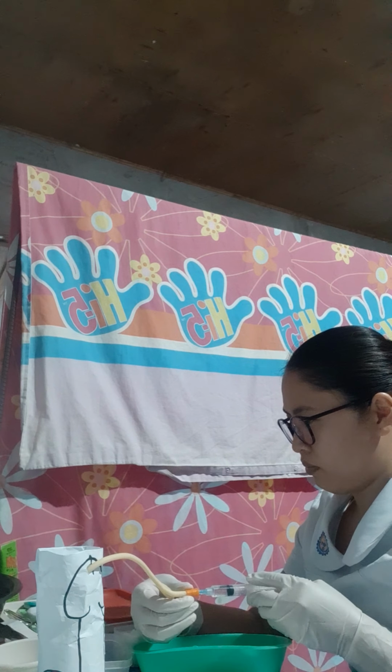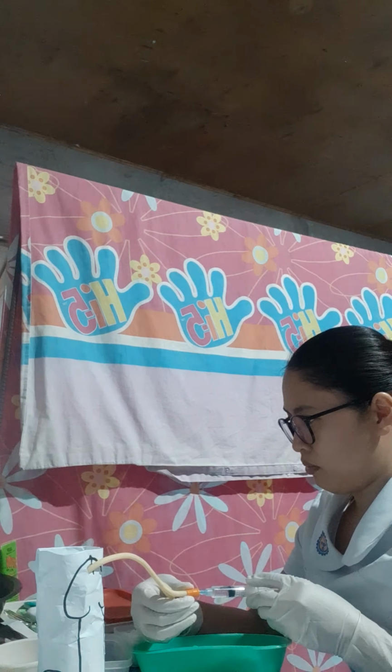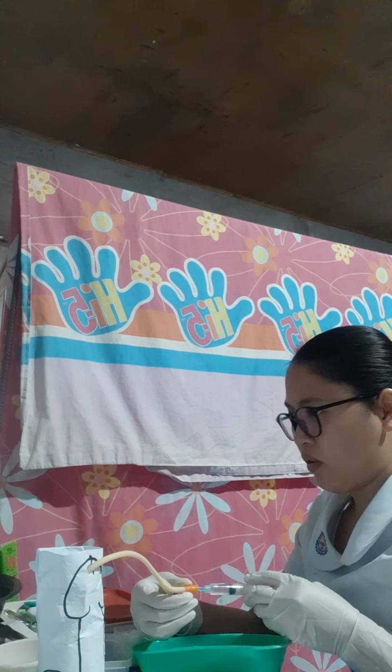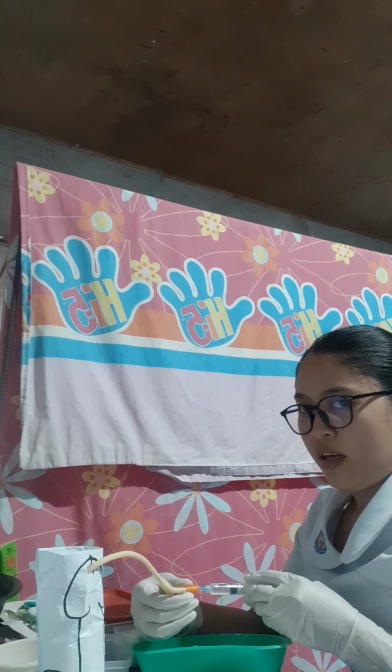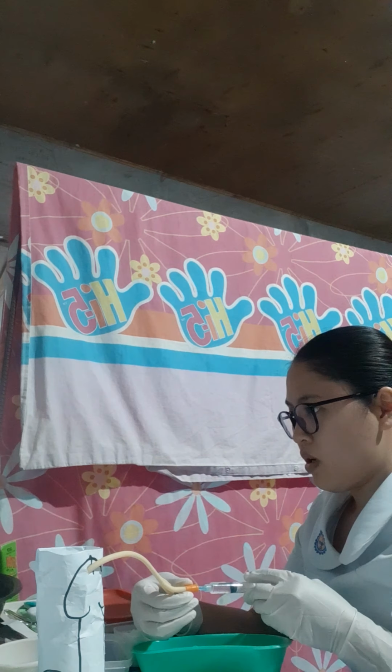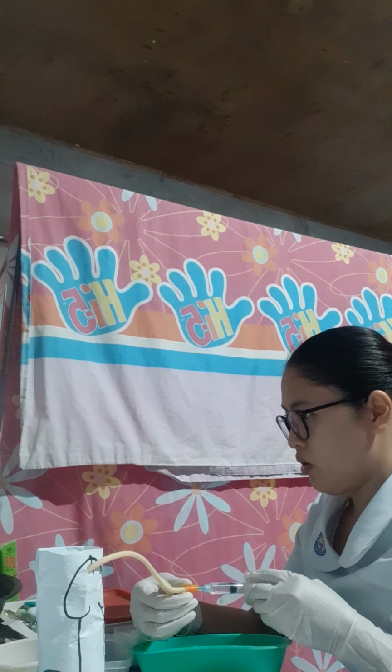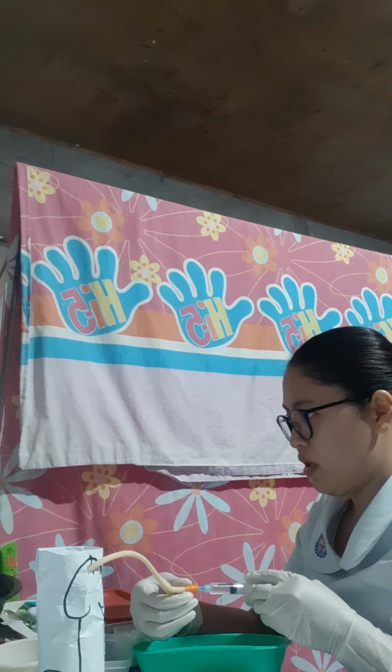Then if the patient complains of sudden pain while injecting it, we are going to aspirate back the solution and advance the catheter further.